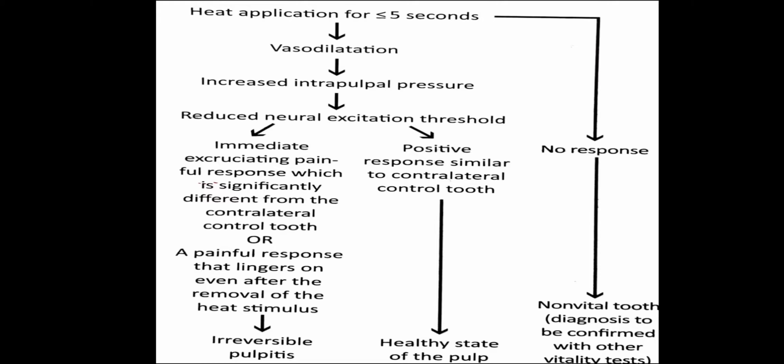And if positive response similar to contralateral control tooth is found, then the pulp is in healthy state.